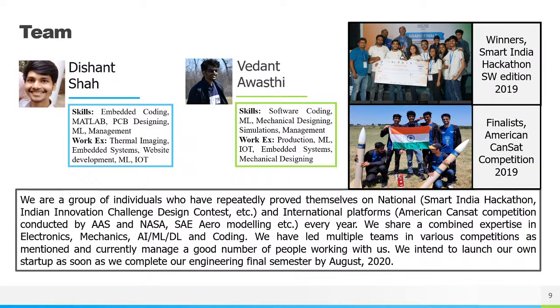So we thought of using our brains to help India tackle this problem, and not just India but also the world.